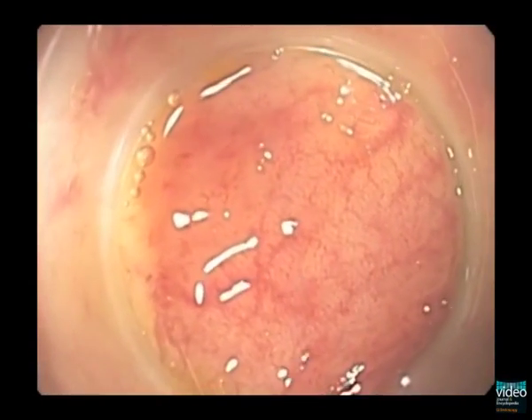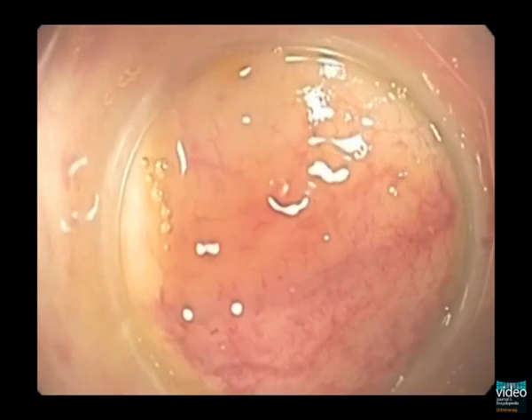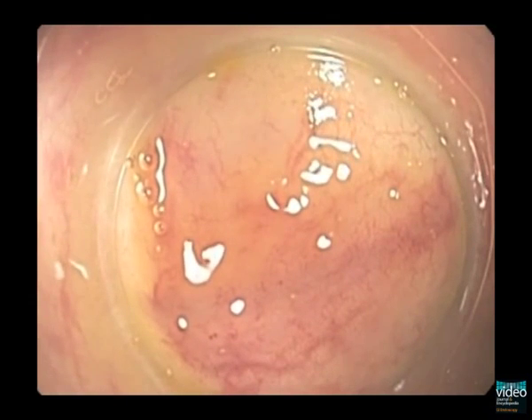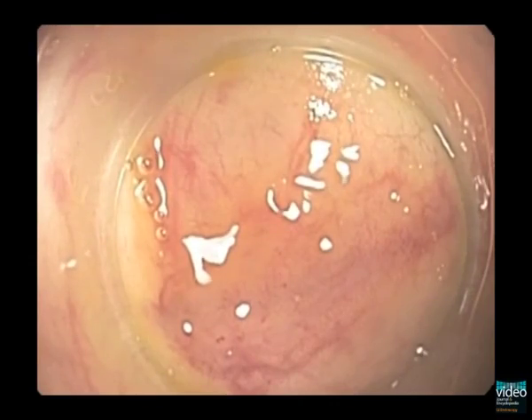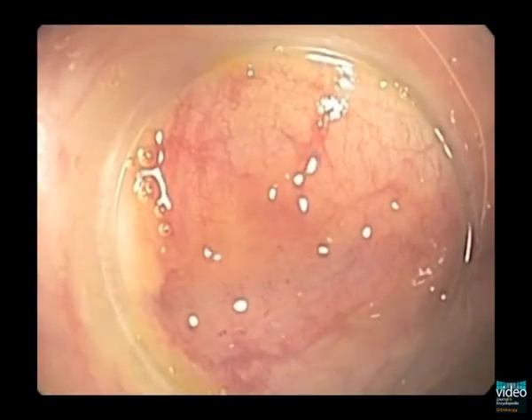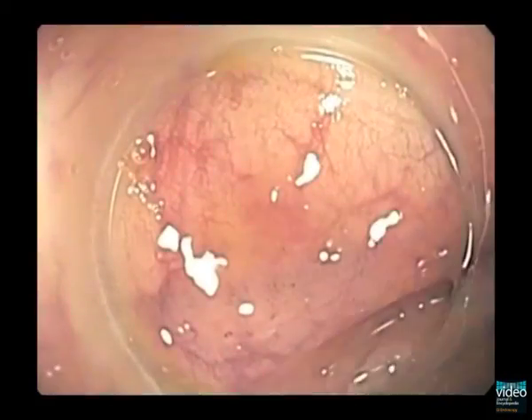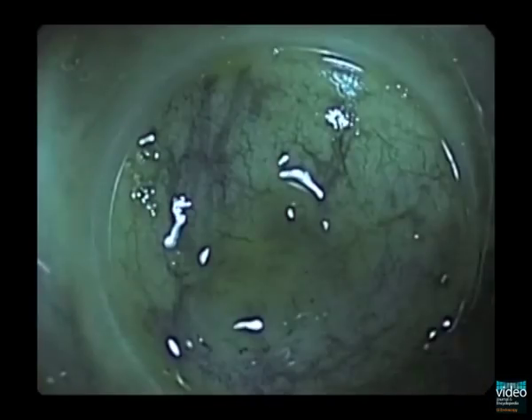Notice we're using a cap to stabilize the image, and we're using both white light and narrowband imaging to further clarify if this abnormality is truly a polyp or just some overlying mucus. In the first image on white light, we see some slight thickening of the epithelium and slight loss of vascular pattern. On narrowband imaging, there's a slight reddish pattern to it. Also note that during the transition between white light and narrowband, there's a slight yellow-golden color suggestive of overlying mucus.